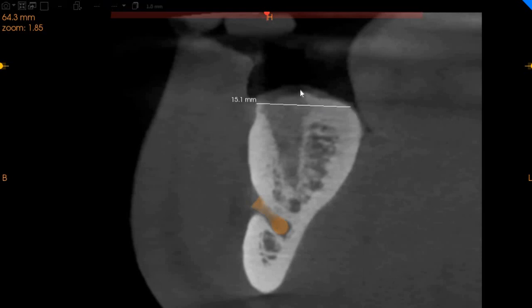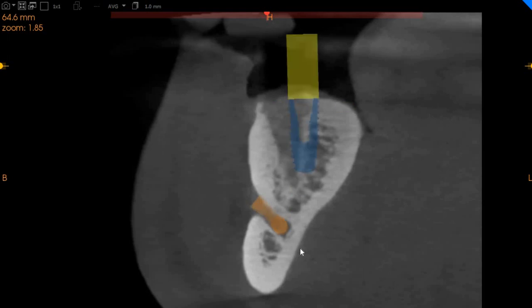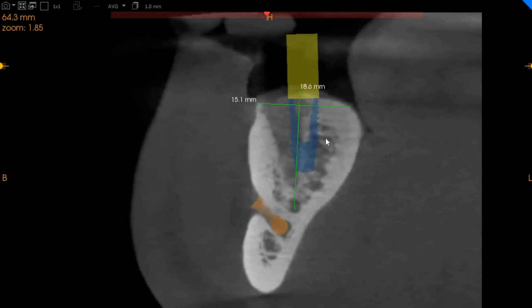You've got 15 millimeters of ridge width with approximately 18 millimeters of height, with D2 quality bone. Even if this area has not been grafted, implant placement here should not be difficult at all. We've placed a generic implant here.